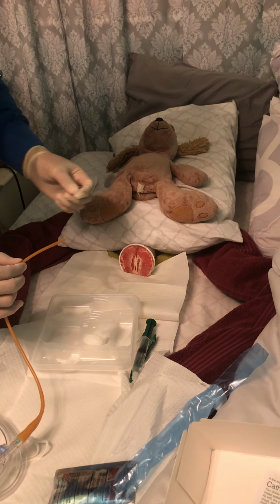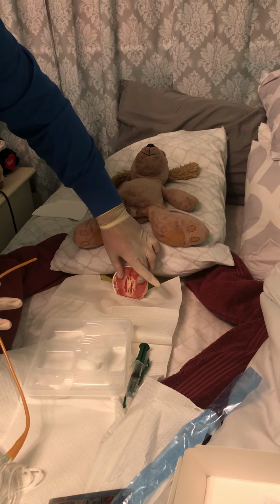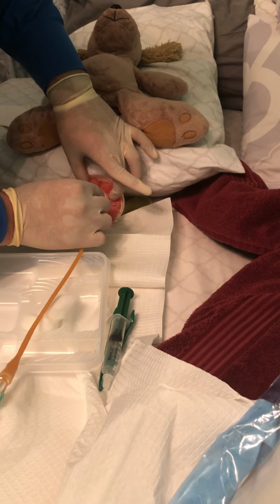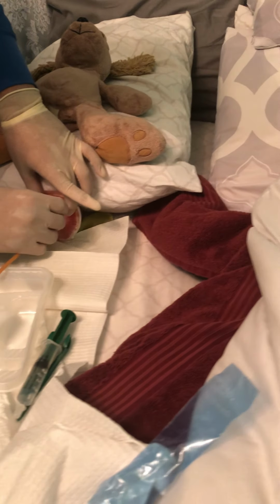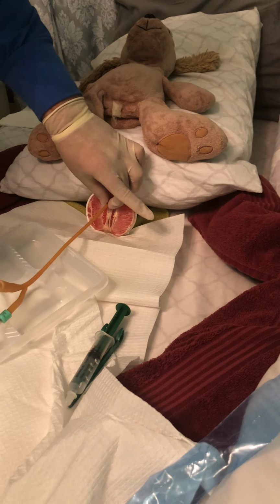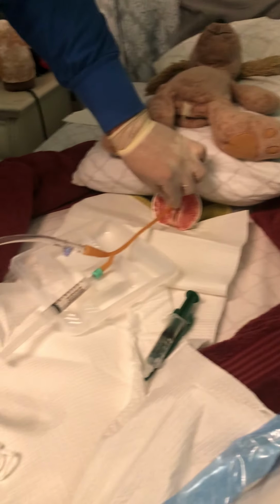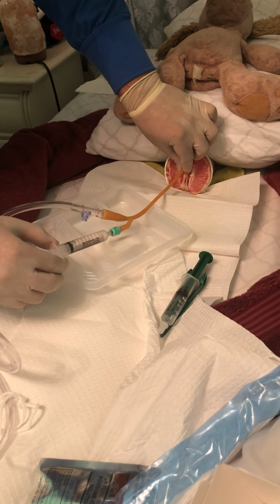And so with the left hand or your non-dominant hand, you will kind of spread the labia, and then you will insert the catheter into the urethra as such. And a way to tell if you're in the bladder or not, you will see pretty quick return into the foley bag. And so once you start seeing return, you want to inflate the balloon.